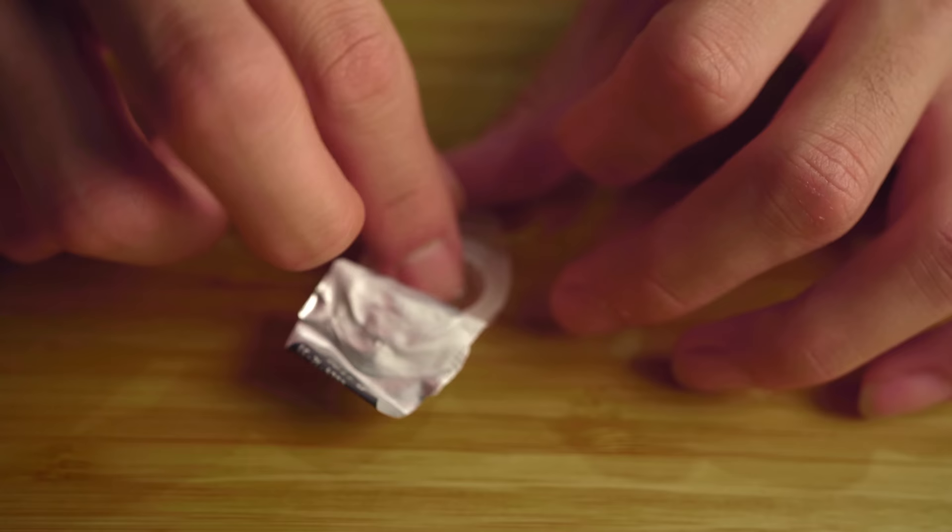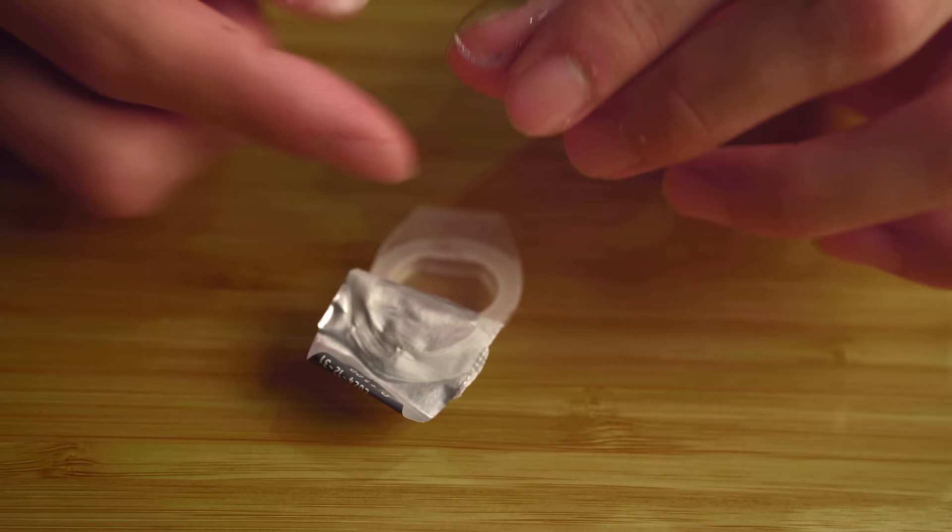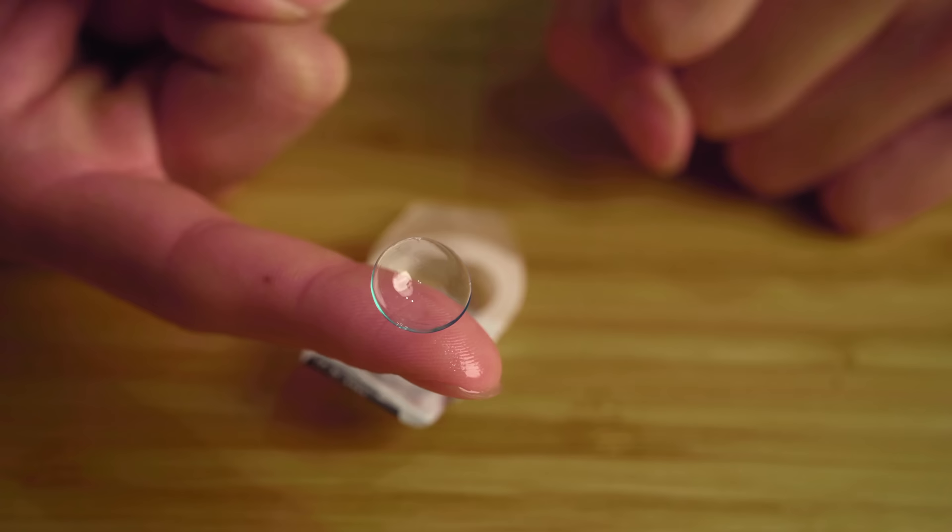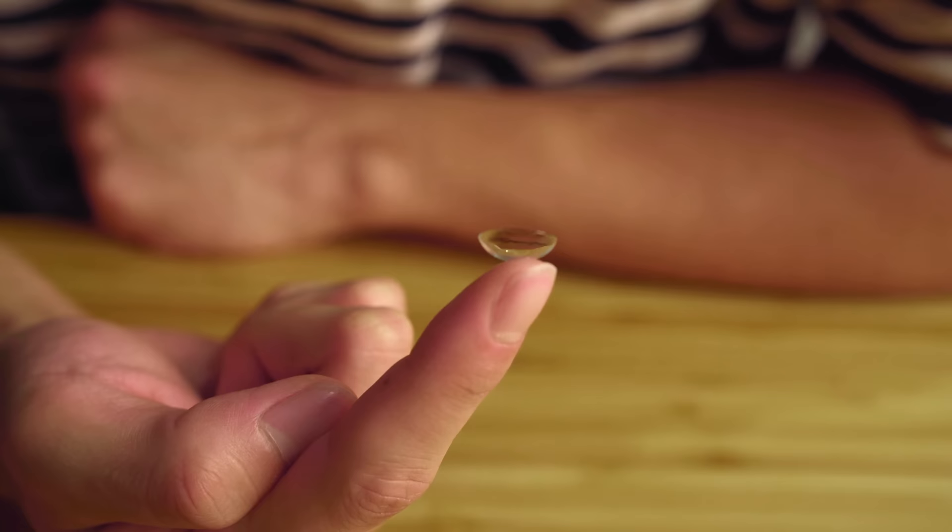Step two, the taco test. Scoop the lens out of the solution and lay it down onto your index finger. Try using the same sided hand as the eye you're about to put the lens into. So for example, we're going to be doing the right eye first, so we will use our right index finger.